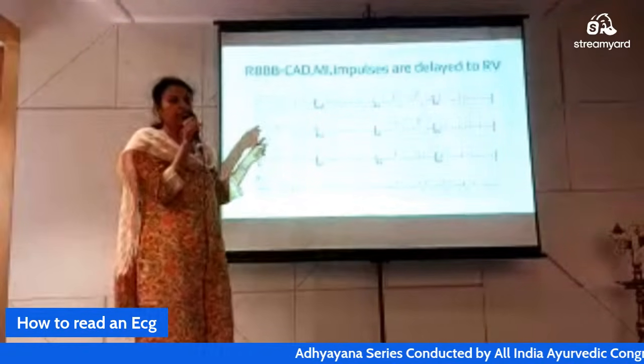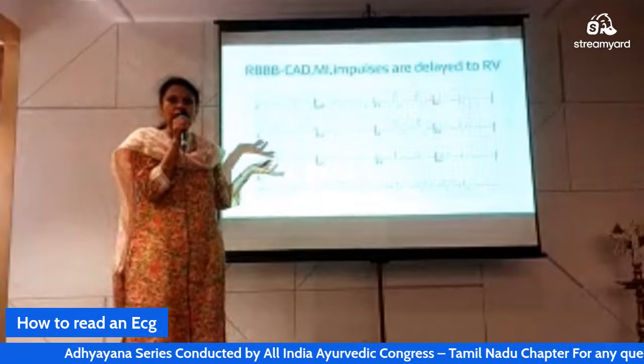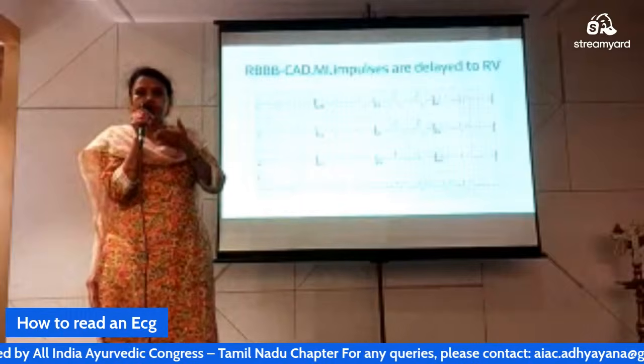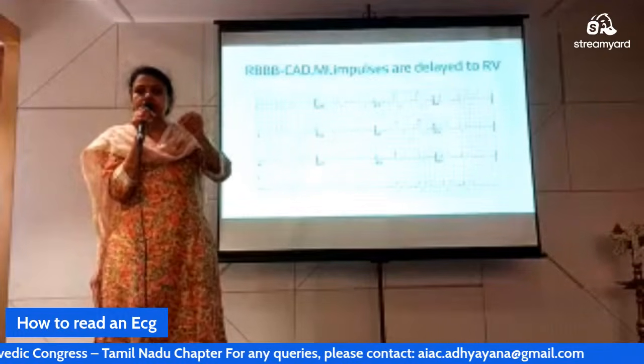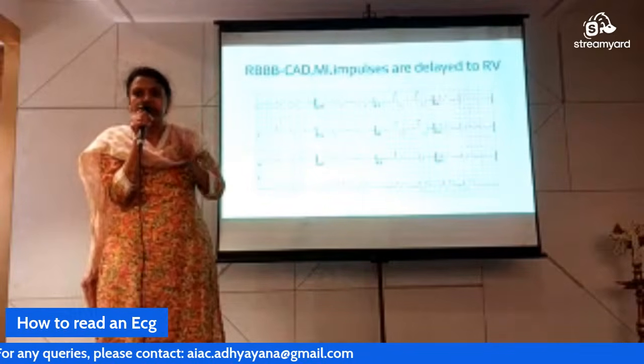They'll always be presenting with the post-operative ECG also. They'll be having an RBB pre-op also. So children, if you go in for a school health children's scheme, you are doing an ECG without even monitoring. The ECG itself, you can see that the patient is having RBB, they'll be having an ASD.